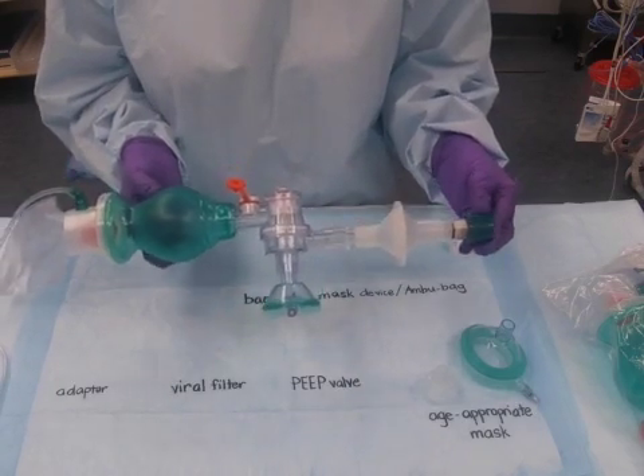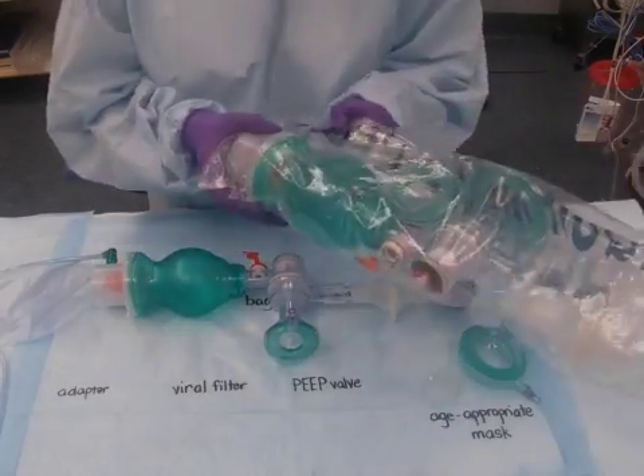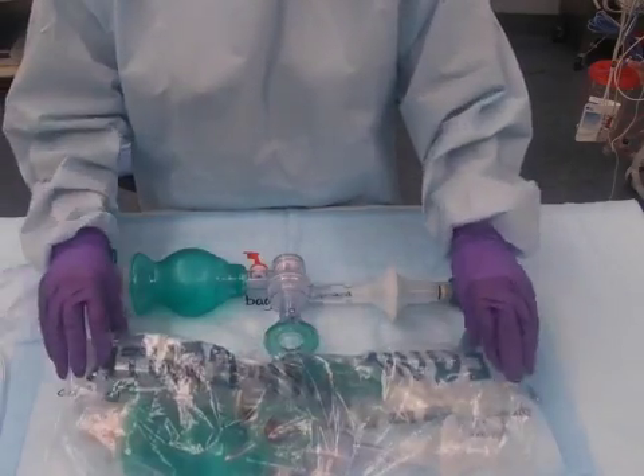To facilitate the team's rapid response, we have preassembled the setup with different mask sizes and stored them in a clean equipment bag placed in the NICU COVID-19 cart.